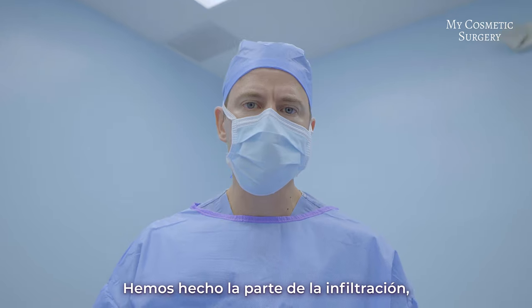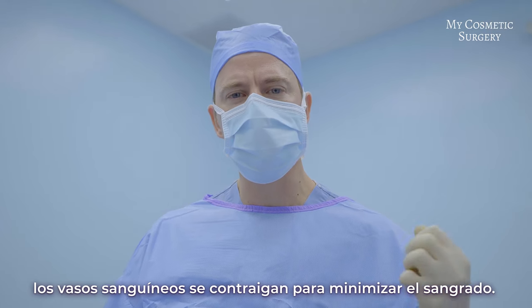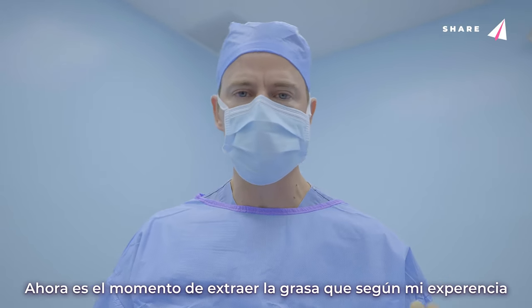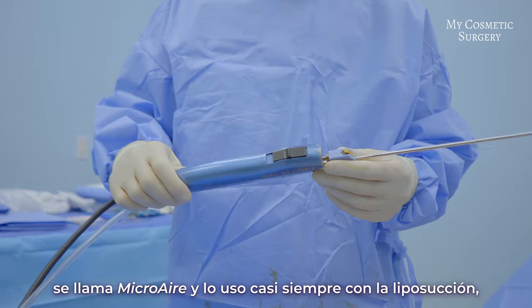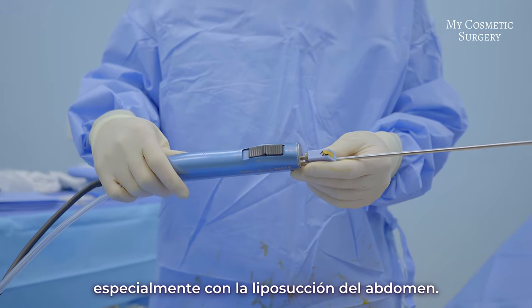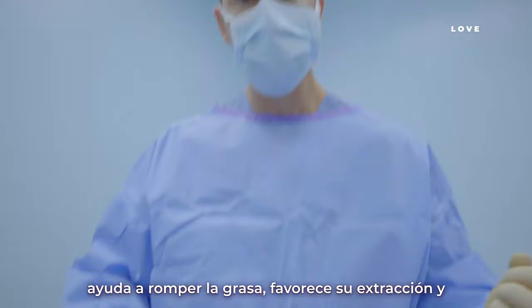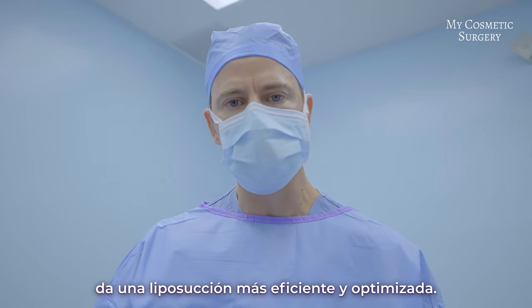We've done the infiltration part and given it a few minutes for it to take effect. Those few minutes allow the blood vessels to really constrict down so we can minimize bleeding during liposuction. Now it's time to extract the fat. I find that fat extraction is done most effectively with this device here — it's called the micro air device. I use it almost every time with liposuction, especially of the abdomen. This device vibrates at the tip, which really helps break up the fat and extract it better, giving more efficient and optimized liposuction.